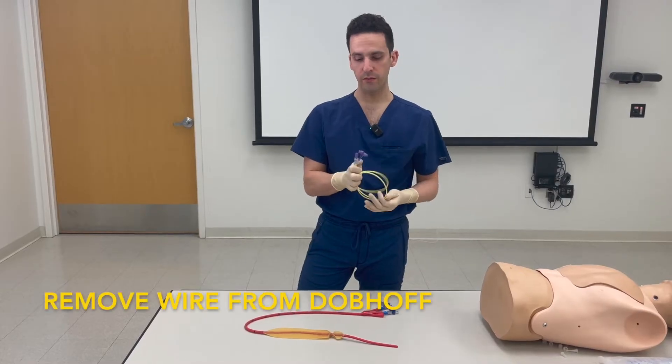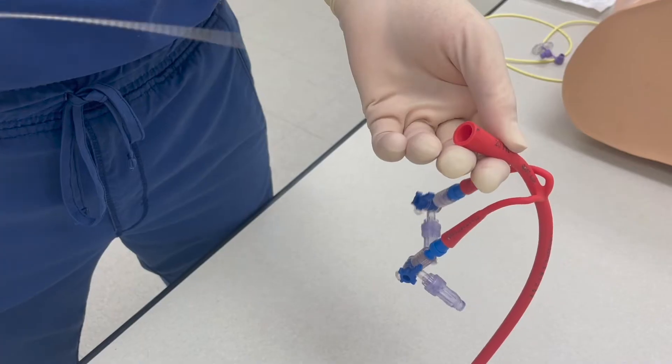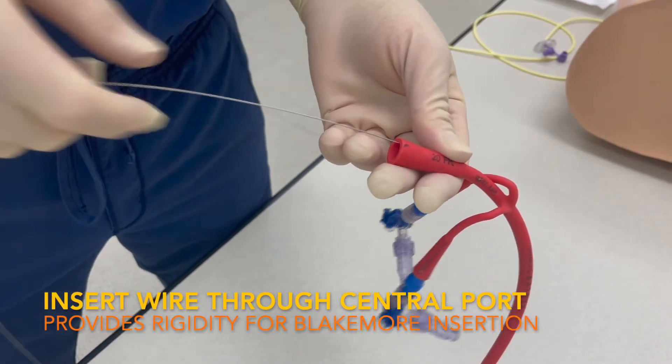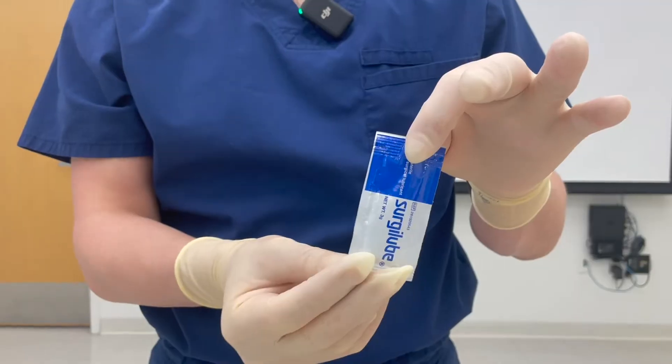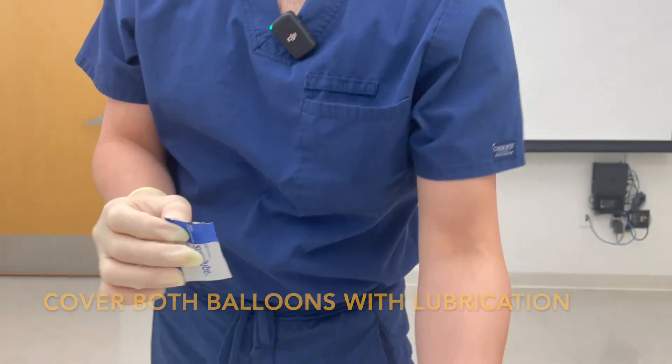Take your Dobhof and remove the wire from the Dobhof. Take the wire from your Dobhof and insert it into the central aspiration port. Thread the wire entirely. Take a packet of lube and cover the entirety of both balloons with lube.